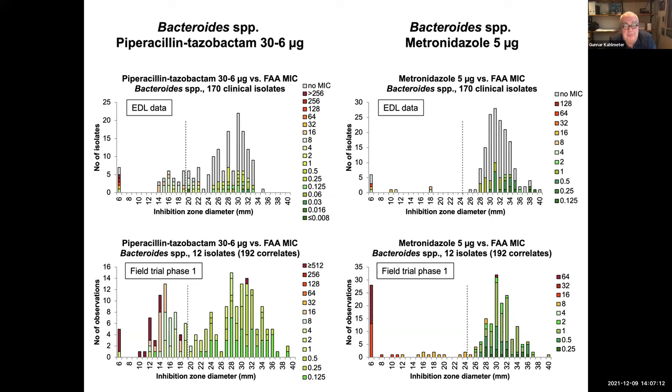We know that there are several suppliers that will supply these plates. The State Serum Institute Diagnostica will do that. I think Oxoid will do that. And maybe Erica, Jenny or Trevor can help me out. E&O will do that, I think. Is that right, Trevor? Yeah, E&O can produce them as well. And I think by connections in the UK as well. And Oxoid plates by Thermo Fisher, as you said, and SSI Diagnostica in Copenhagen.